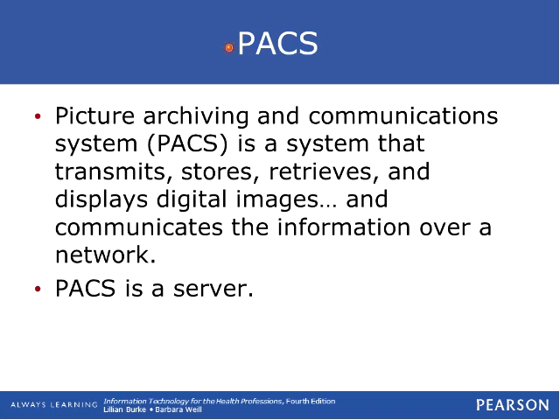PACS, my favorite thing to talk about, is Picture Archiving Communication System. It is the digitalization of radiology, and it transmits, stores, retrieves, and displays digital images and communications information over a network. PACS is the server, so it stores all of this. And then we put monitors throughout the hospital.